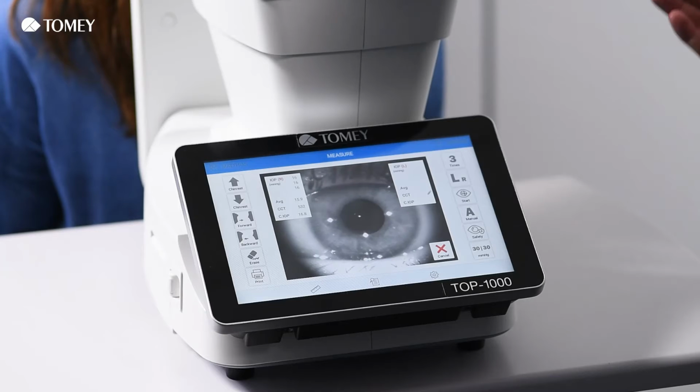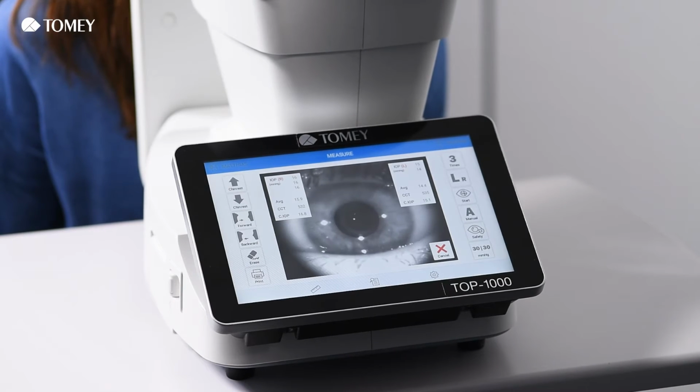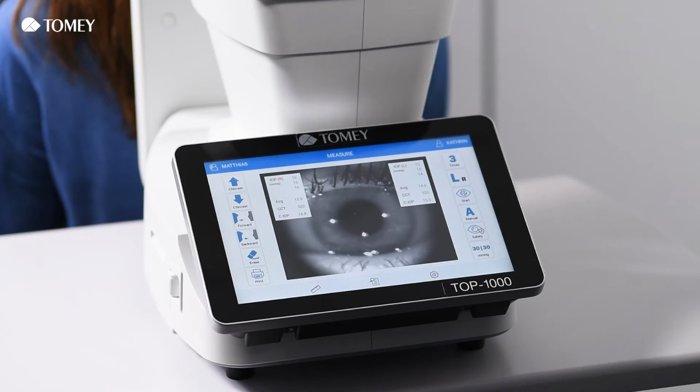And we do the same procedure again. So first of all you see some blue flashes, and then there will be a slight air puff coming out of the system. Don't be afraid. So now we have the Scheimpflug measurement. Okay. And another one. So basically, that's it.